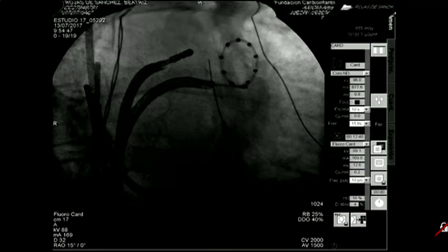You know, when you looked at the venogram, the length of the vein was not as long and as deep as where the wire is now. Is that common in your experience? Very common. Remember, it's a non-selective venogram that we did through contrast injection. Can you say that in Spanish, please, Miguel, for the audience benefit?